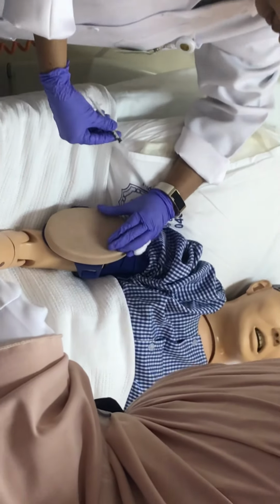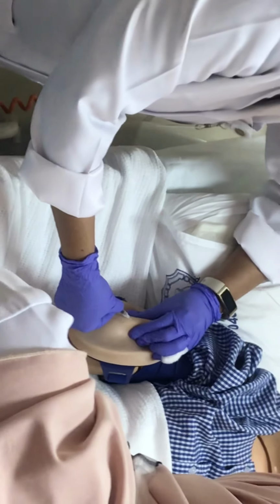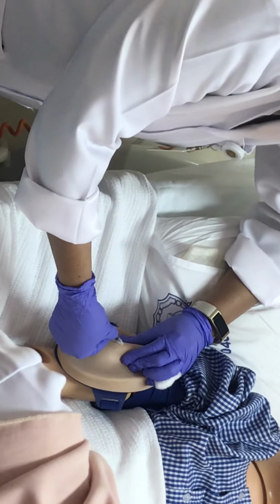Smoothly it should start going in. See, pinch like this. And see the side, the sharp, this is a 45-degree angle. Okay. Go inside like this. You see the shaft going down, my hand. Now I need not pinch anymore because I'm very sure I'm in subcutaneous.